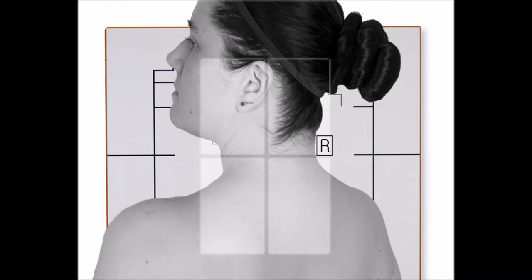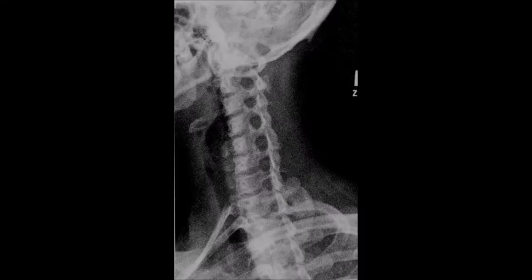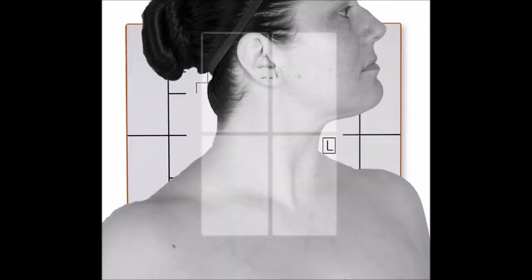Protract chin slightly to prevent superimposition of the mandible and vertebrae without superimposing the base of the skull over C1. If superimposition occurs, the head can be turned laterally.